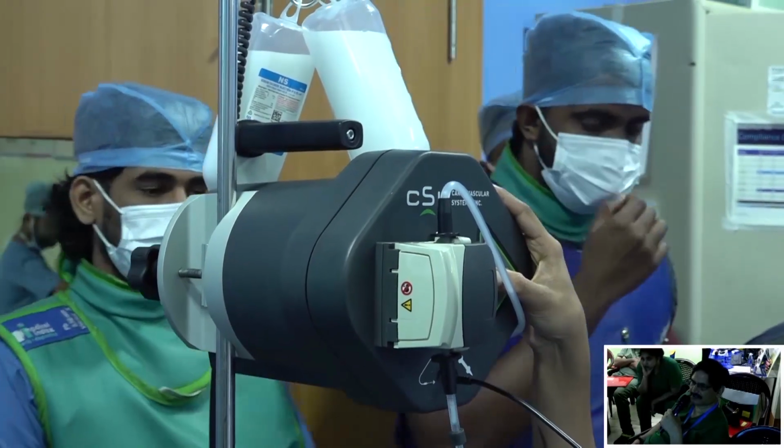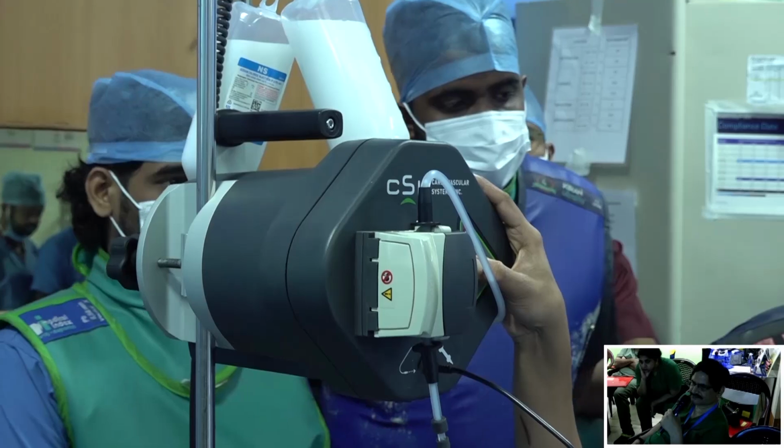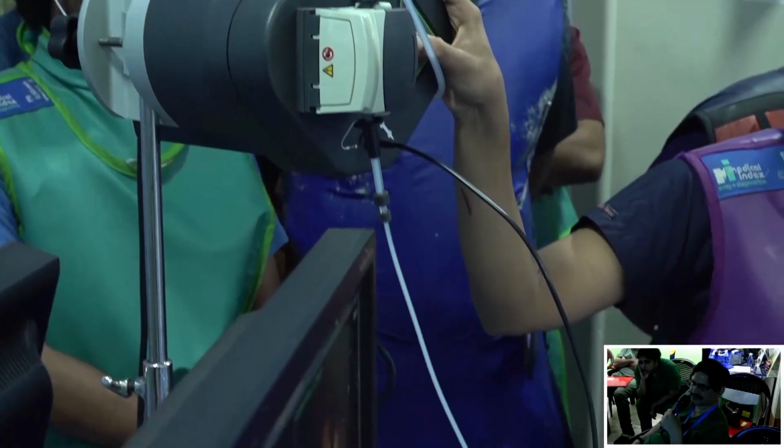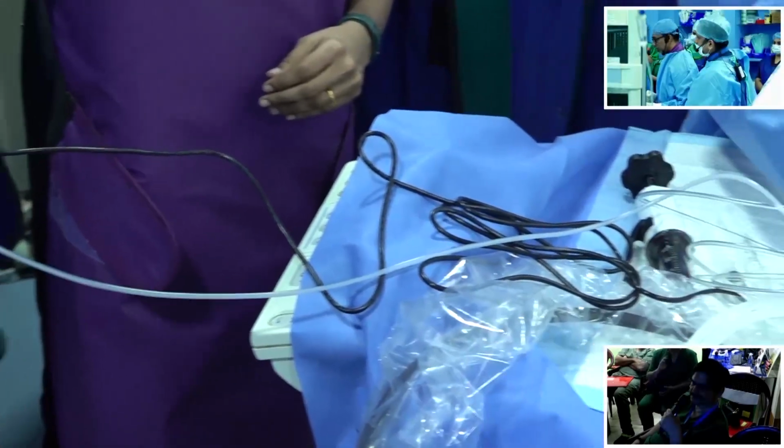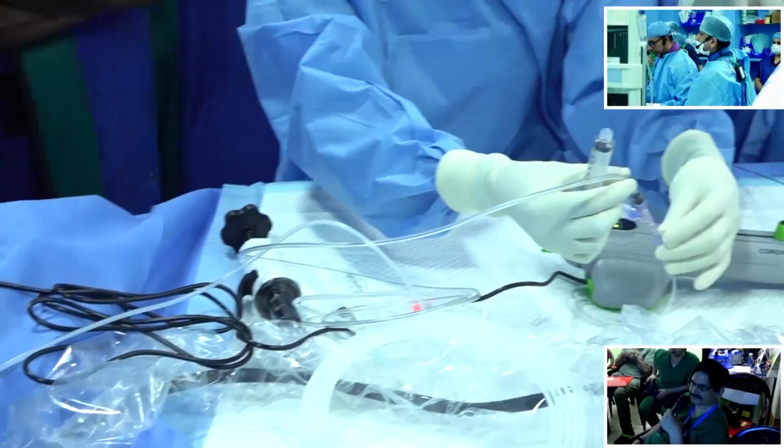It's aerating the bubbles. So carefully see, they prime the catheter so that there is no air bubble inside that. Okay, you can show the tubing.